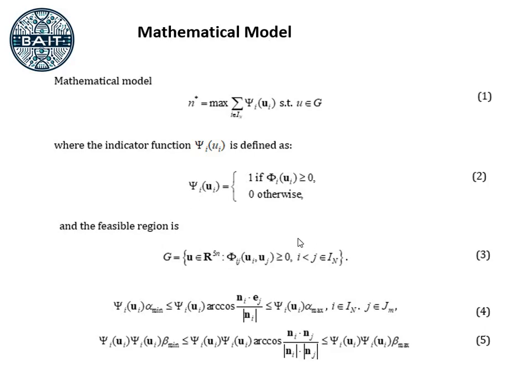This is achieved by means of the phi-function technique. These functions describe spatial relationships between capsules, their components, and the surrounding anatomy.